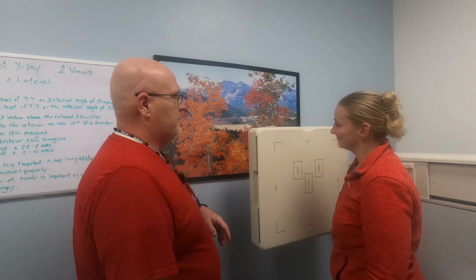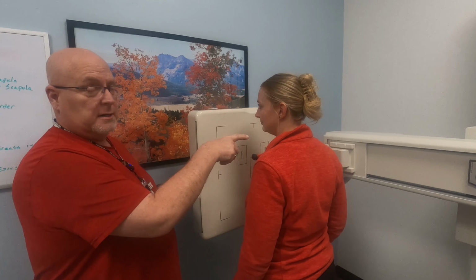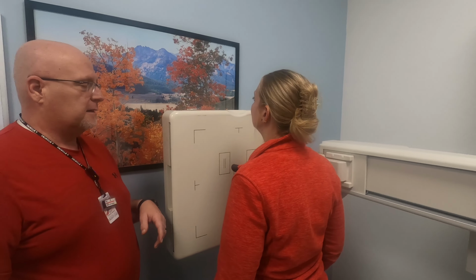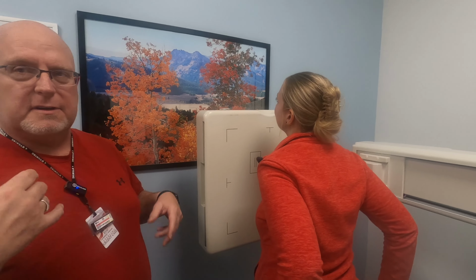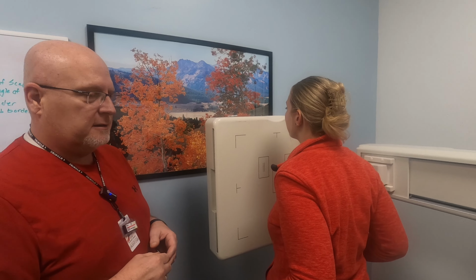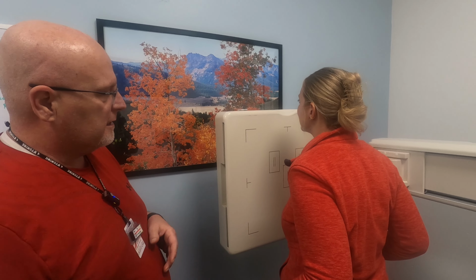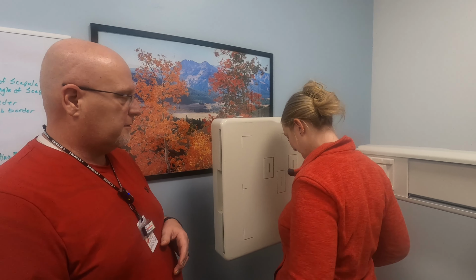Okay, so let's just go over here to Kate. By the way, we got Kate and Mikkel here again. So we're going to do a PA chest. I would have Kate take off her jacket as well as her necklace and any bra straps or anything like that. It's just easier if a woman takes off the bra. We'll get history. We'll also find out if she's pregnant or anything like that.